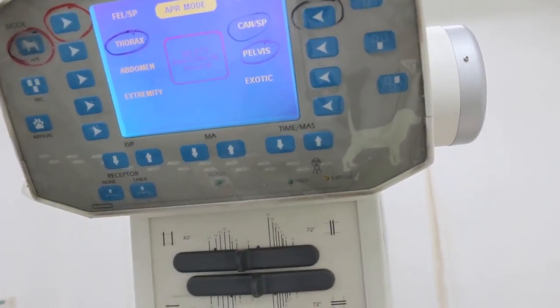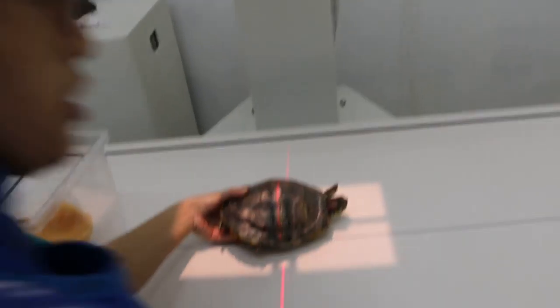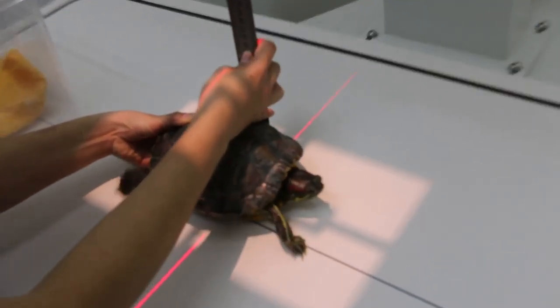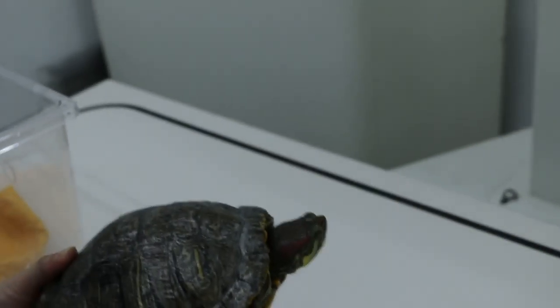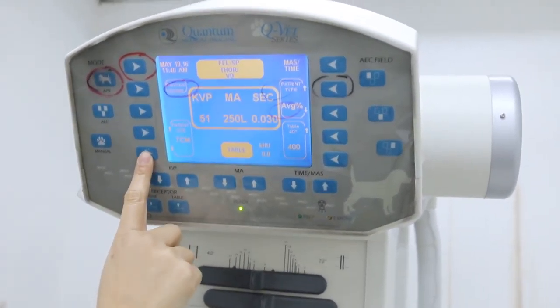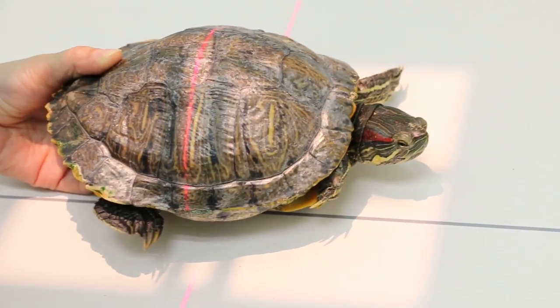Then it will move. Maybe do it inside here — cannot. Must prevent it from moving. Is there something to block it from moving? So we do the measurement, the height here. We'll do the adjustment first. Quantum digital x-ray. I think we must stop it from moving and block it.